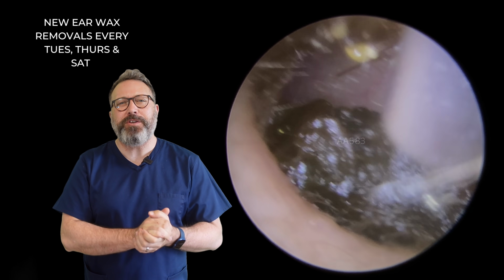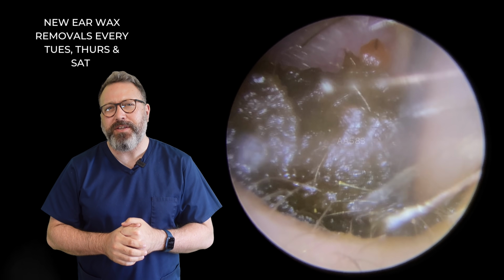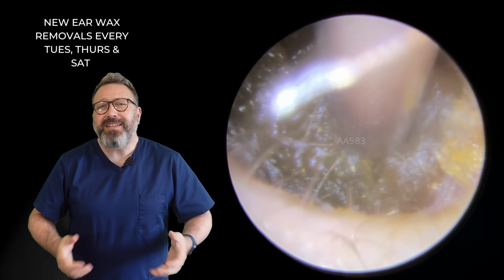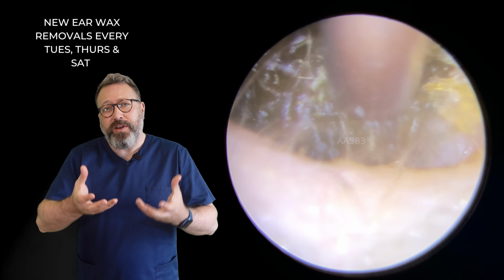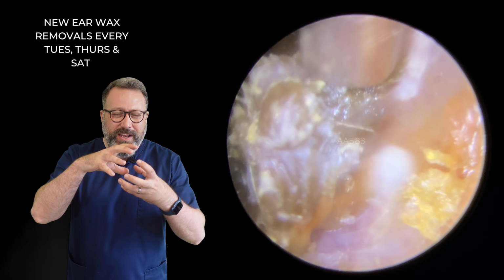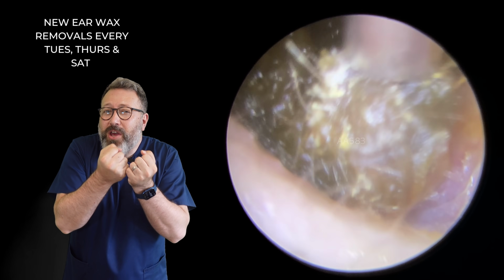So you can see this first patient's got this very hard little piece of dry, dark colour wax here. It's really firmly holding on to that ear canal wall. So we're going to need to lift this off, detach it from the canal wall before we can start to bring this down the canal. So you can see a lot of dry skin underneath there where it's really kind of dried around those lifts of dry skin at the entrance to the canal, which is what's held it in place.